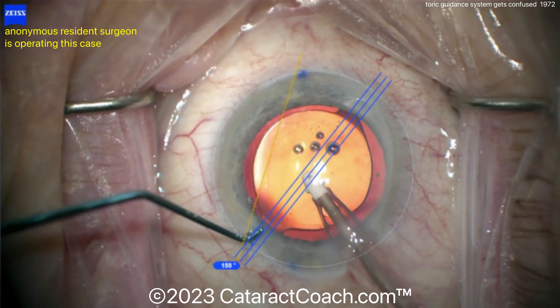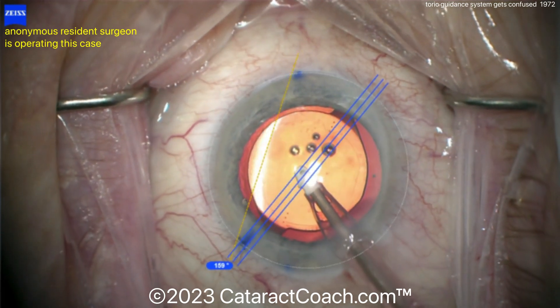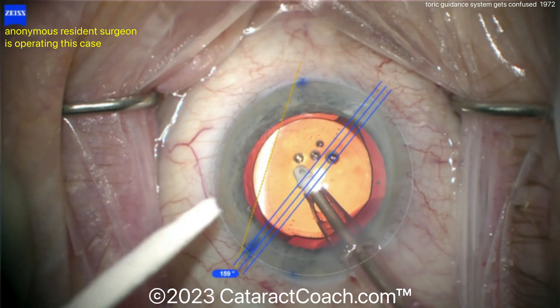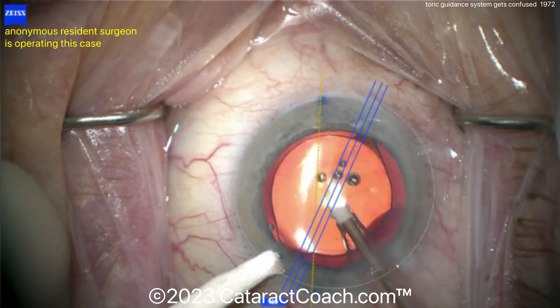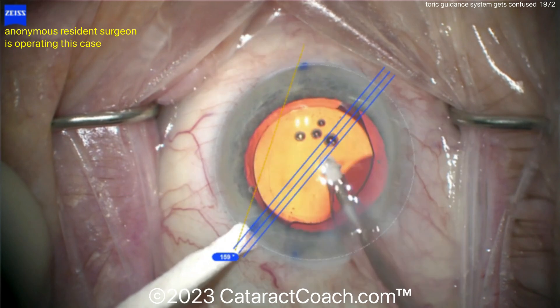Now you can see — the chopper is not blocking it enough. Get a Wexcel sponge and block that completely. Because when you block it with a Wexcel sponge, the machine says okay, that's the other 180 mark, and it changes the axis. Now you can have a more accurate axis.